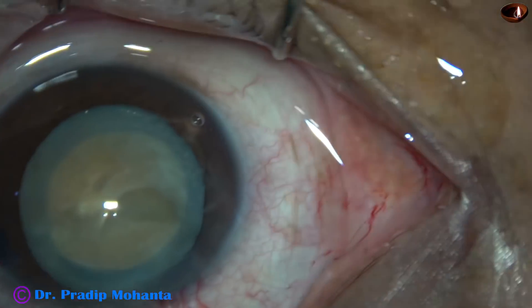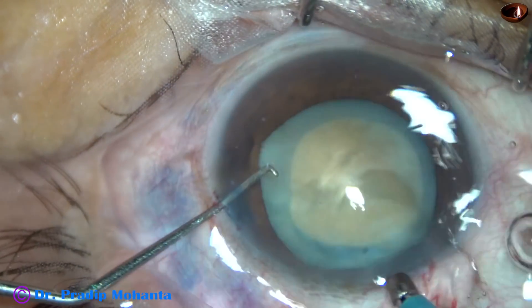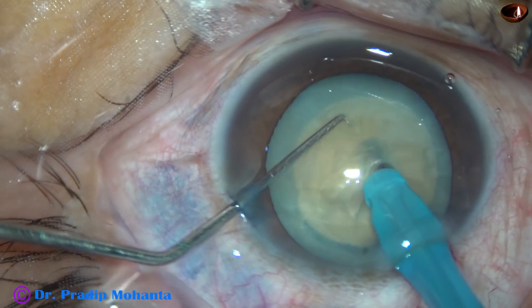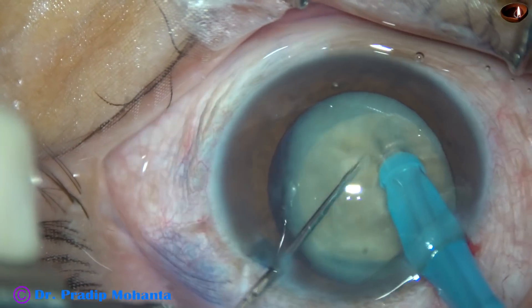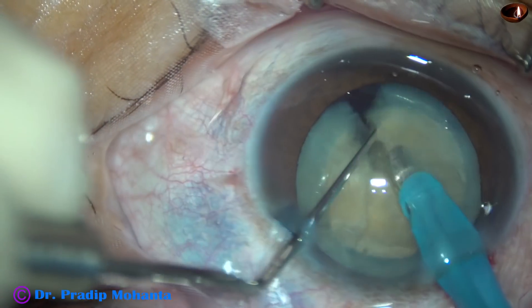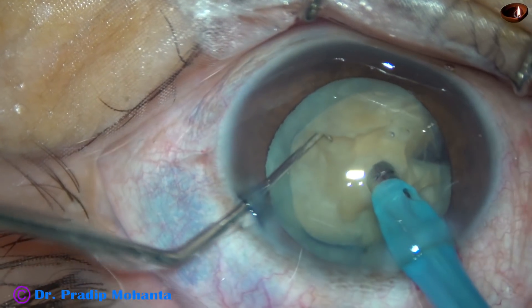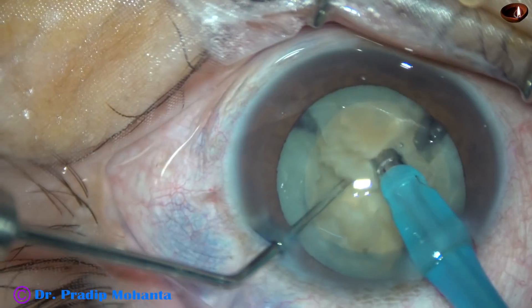And now, my plan is to go into the substance of the nucleus with bevel in, at a deeper plane. So, I engage it here, go into the substance of the nucleus, go really deep, and then try to get a crack. And with four or five attempts, I could get a crack. And now, I get this endonucleus, make the bevel up, and go into this endonucleus — and I could crack this endonucleus.